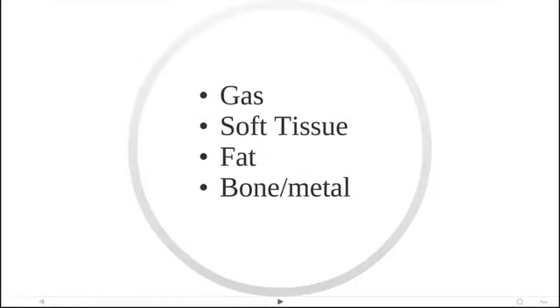As I'm sure you remember from the podcast on chest X-rays, there are four basic radio densities you need to know about when assessing plain abdominal films. Gas shows up as black on a plain film, and in the context of abdominal films is important when looking at intraluminal and extraluminal gas.